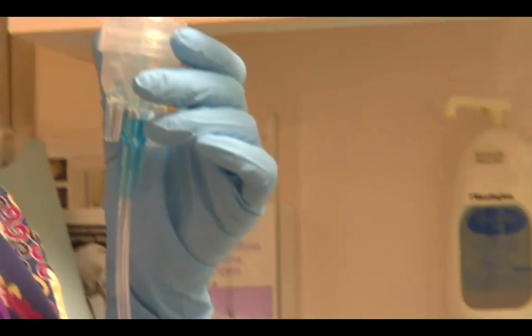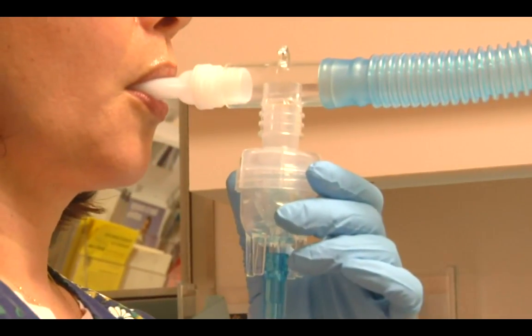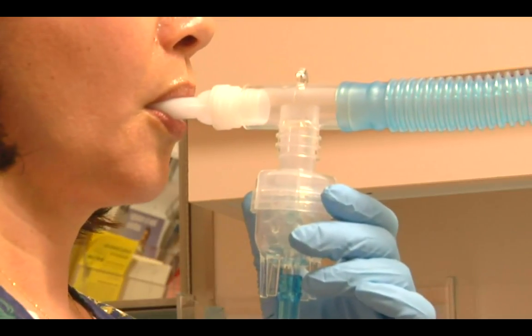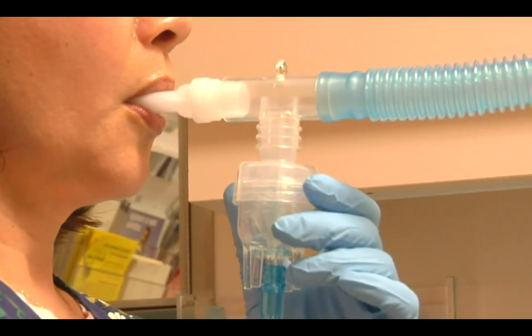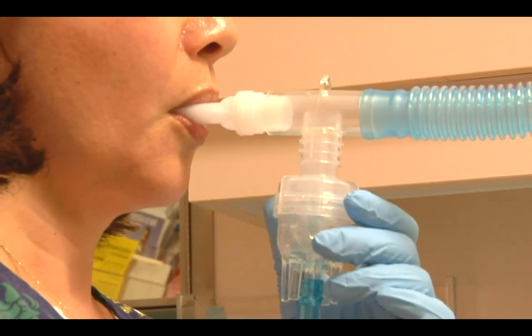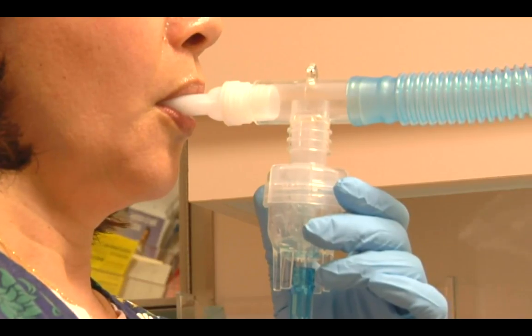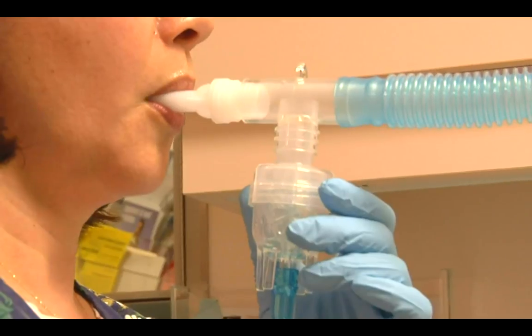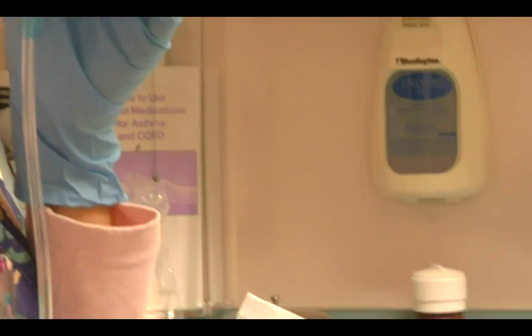We're going to put it directly in our mouth and then take slow, deep breaths. Every couple of breaths, we really try to hold it down. The biggest problem with nebulizers is that sometimes patients will be trying to inhale too rapidly. So we always want to slow the patients down and take just slow, deep breaths.